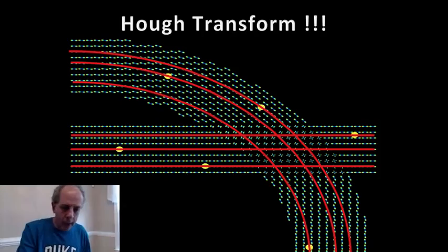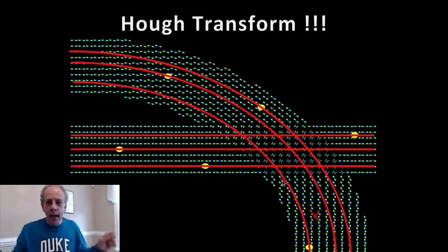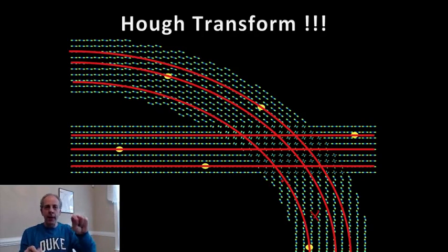And then you say, is this point connected to a point, let's say, here? If there is not a strong cable, a strong curve, then you say they're not connected. You can actually make a binary decision, yes or no, or you can make a probability decision. Oh, this is the probability that they're connected. And the probability is, as in the Hough transform, the addition of the local probabilities at each voxel, in the same way that when we were detecting circles or straight lines, we were saying what's basically the chances that this straight line had many local edge detectors along its way.